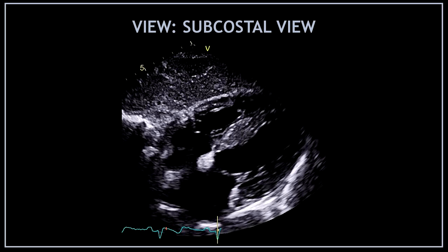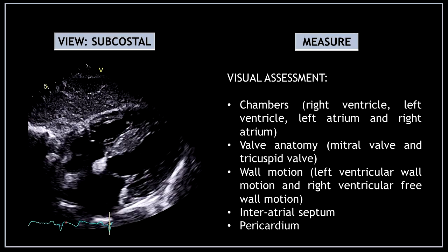This is the subcostal view, and I'm going to show you one by one all the measurements you need to obtain when analyzing this view. First, obtain a subcostal view and perform a visual assessment of the cardiac chambers: the right ventricle, left ventricle, left atrium, and right atrium. Also visually assess the mitral valve anatomy and the tricuspid valve anatomy, then assess the left ventricular wall motion and right ventricular free wall motion.